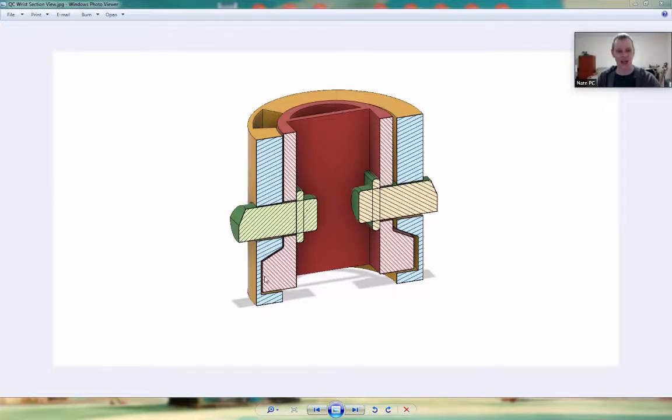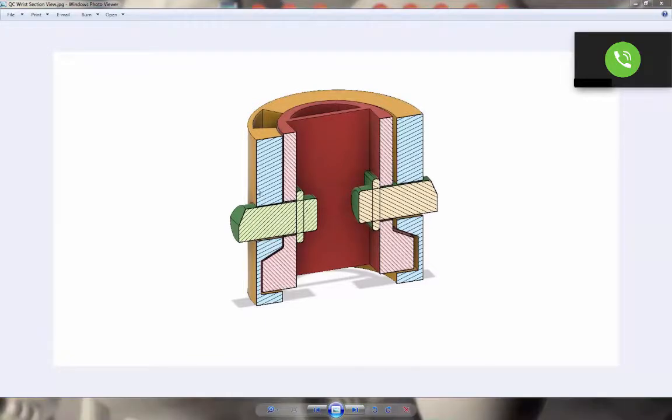What it's based on is an L-shaped slot that this key down here will slide into at the top, slides into the bottom, and then twists till this pin will engage through a hole. And so this quick connect wrist will be used, basically the palm would normally connect right here at the fixed side on the bottom. That's why I'm saying it's kind of backwards in application, but due to the beauty of Fusion 360, it should be really easy to flip it over. I just didn't want to do that to Alex right before the meeting. She was trying to get things all coordinated so it would look pretty for the meeting.